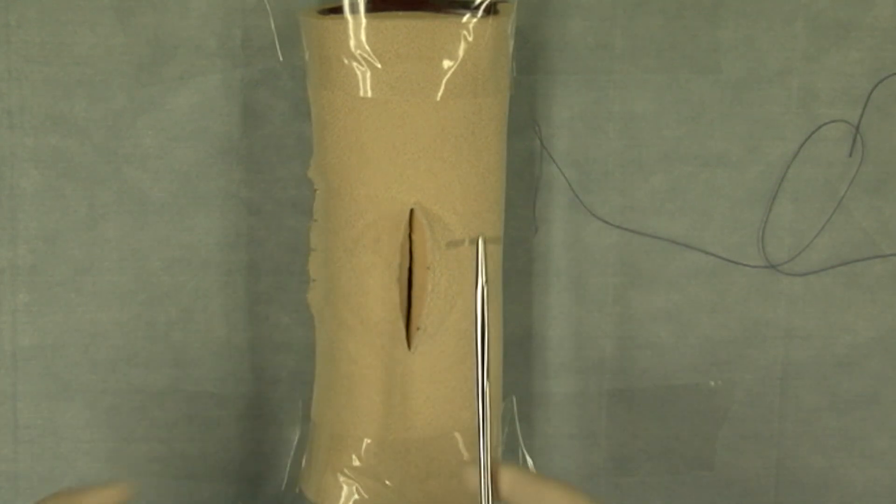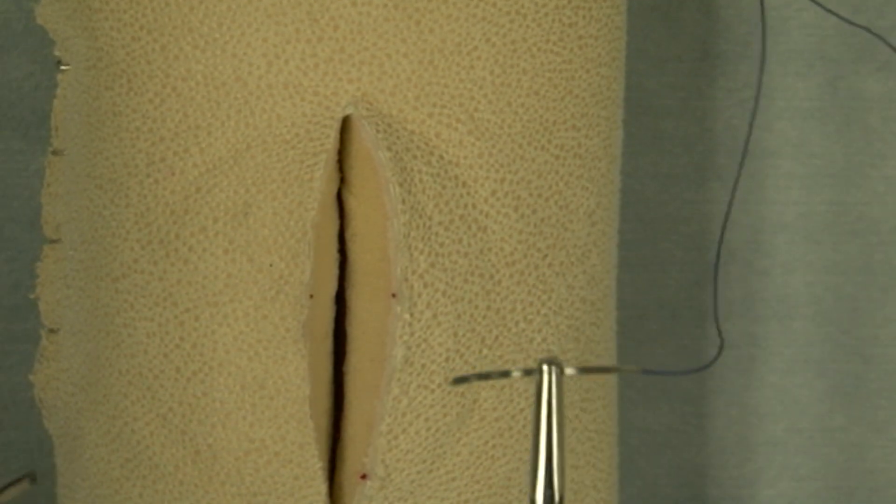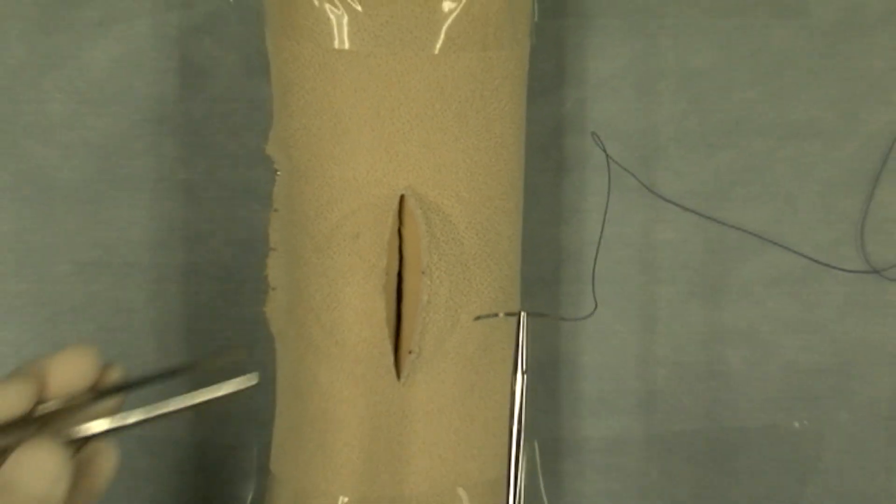Notice that I have the needle holder positioned in the center of the needle, securely clamped in position, properly using the thumb forceps as well.